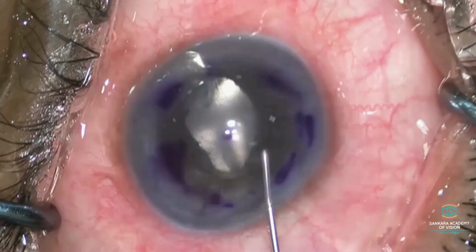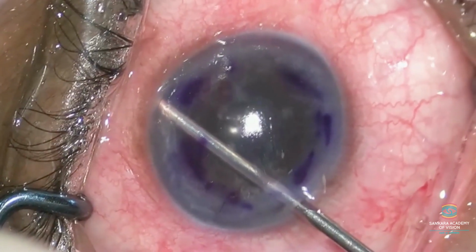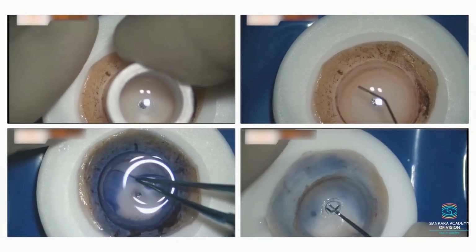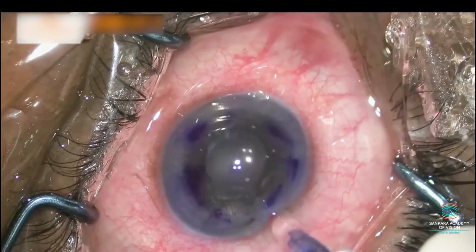0.2% pilocarpine is injected to bring down the pupil size. Peripheral iridotomy is made at 6 o'clock using the cutter. Visco wash is performed. A standard protocol is followed to make a 7 mm DMEK graft. Graft is then loaded using the injector prepared from the IV cartridge.